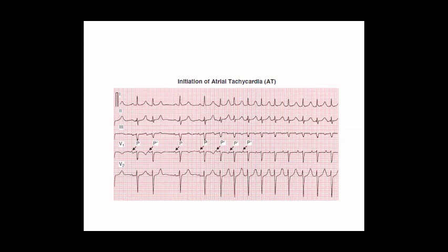For our colleagues not very experienced in ECG, we know sinus rhythm first by detecting the QRS complex. The QRS complex is usually the easiest thing to detect in the ECG. I use lead 2 and look before each QRS complex. I usually see this clear P wave. This is the sinus P wave. Here I find no clearly visible P wave, so this is atrial tachycardia.